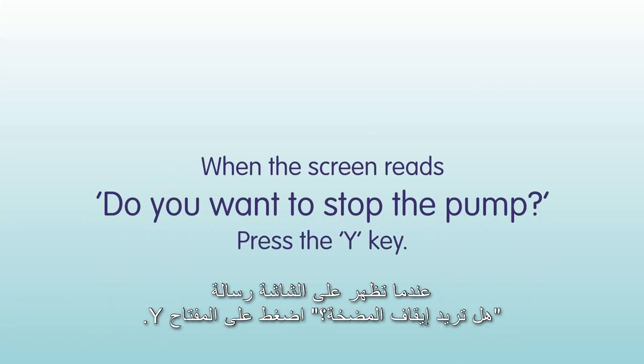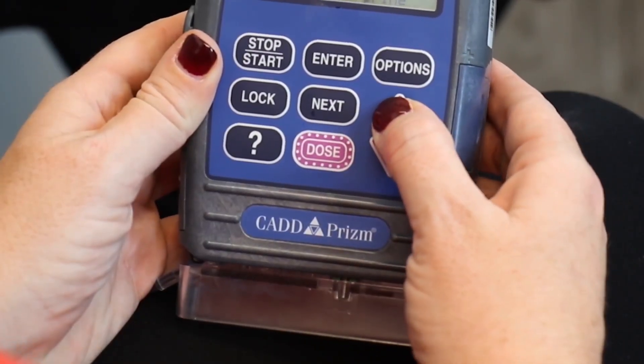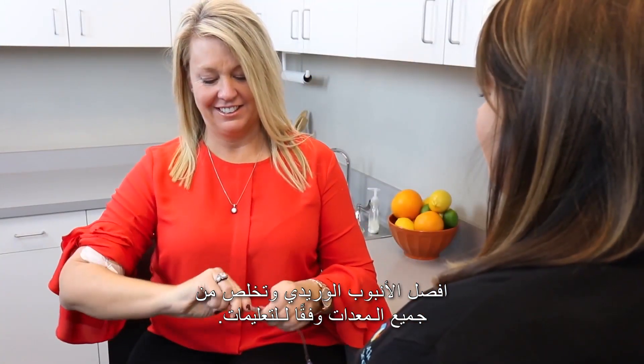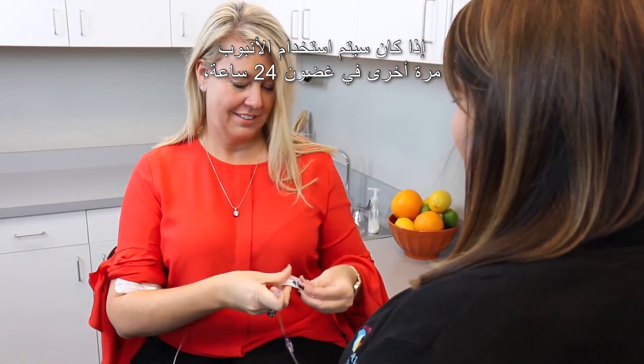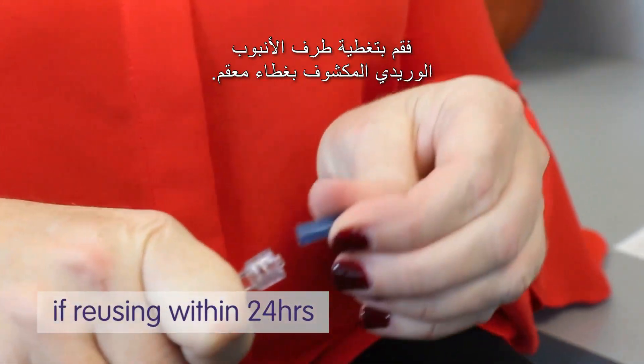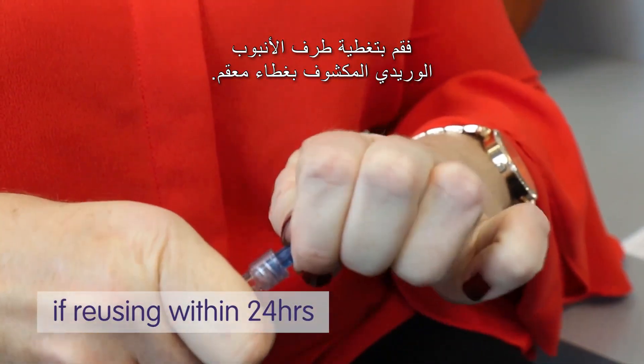When the screen reads "Do you want to stop the pump?", press the Y key. Disconnect the IV tubing and discard all equipment as instructed. If the tubing is to be used again within 24 hours, cover the exposed IV tubing tip with a sterile cap provided.